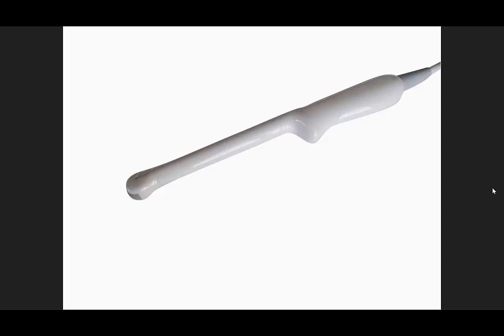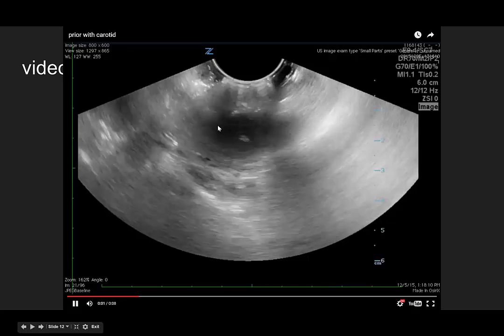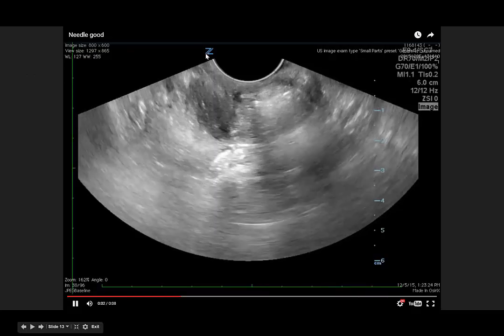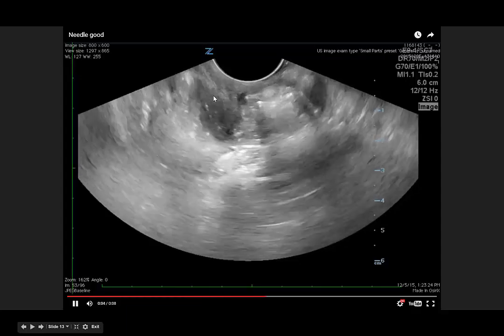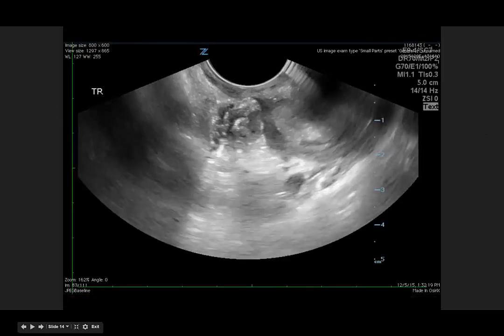I'm sticking with the endocavitary probe. When you take the endocavitary probe, you place it directly onto the patient's peritonsillar abscess — obviously after they've gotten whatever numbing medication you want, so you don't accidentally gag them and have them vomit all over you. You're going to see your abscess, and then right beneath it, here's your carotid. Here's a video of our patient: here's his abscess on the endocavitary probe, here is his carotid. You can see the needle entering the abscess — I'm sorry I missed the very moment when the needle actually penetrates into that pocket of pus. But we have a post-drainage video: no remaining abscess.